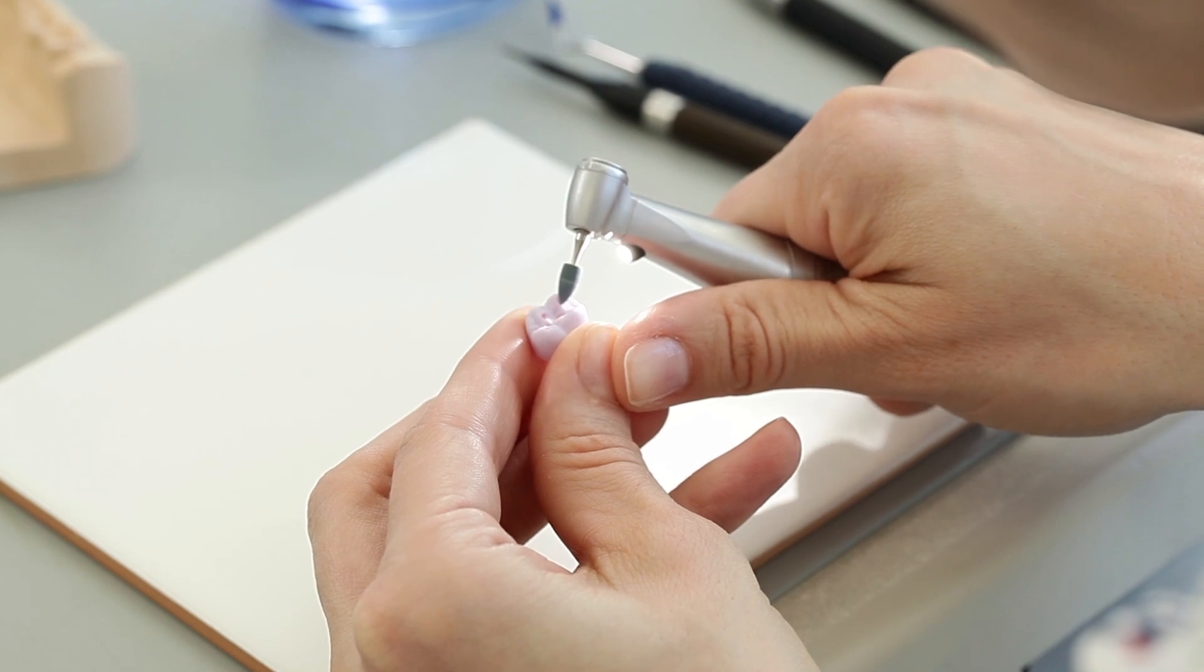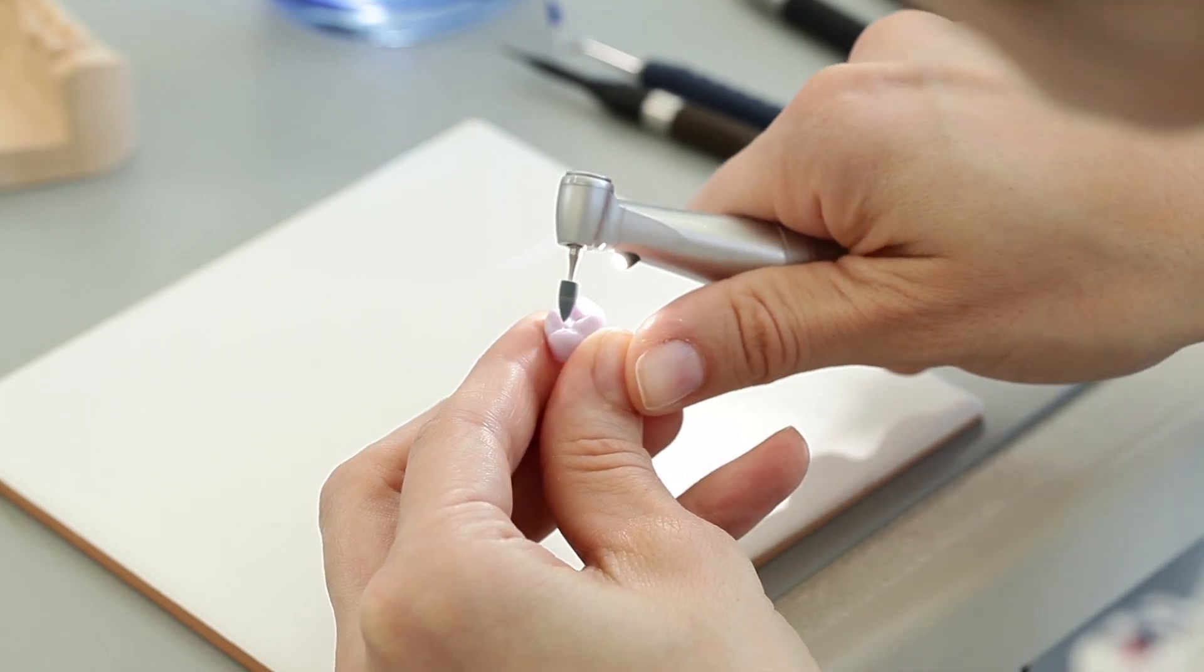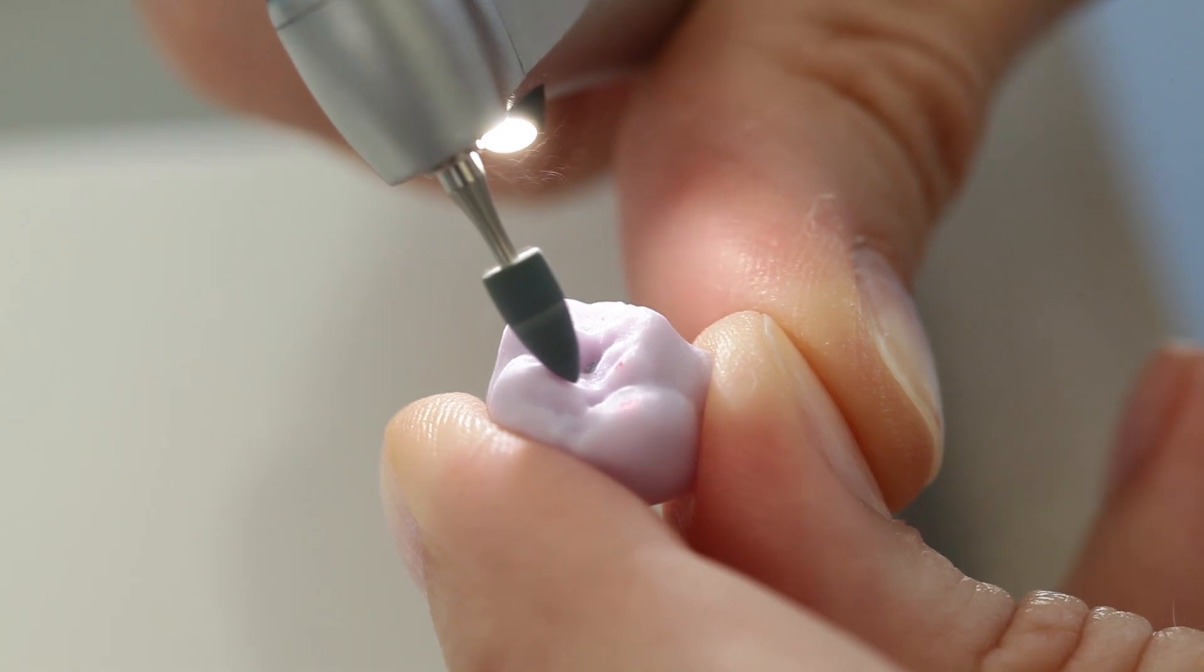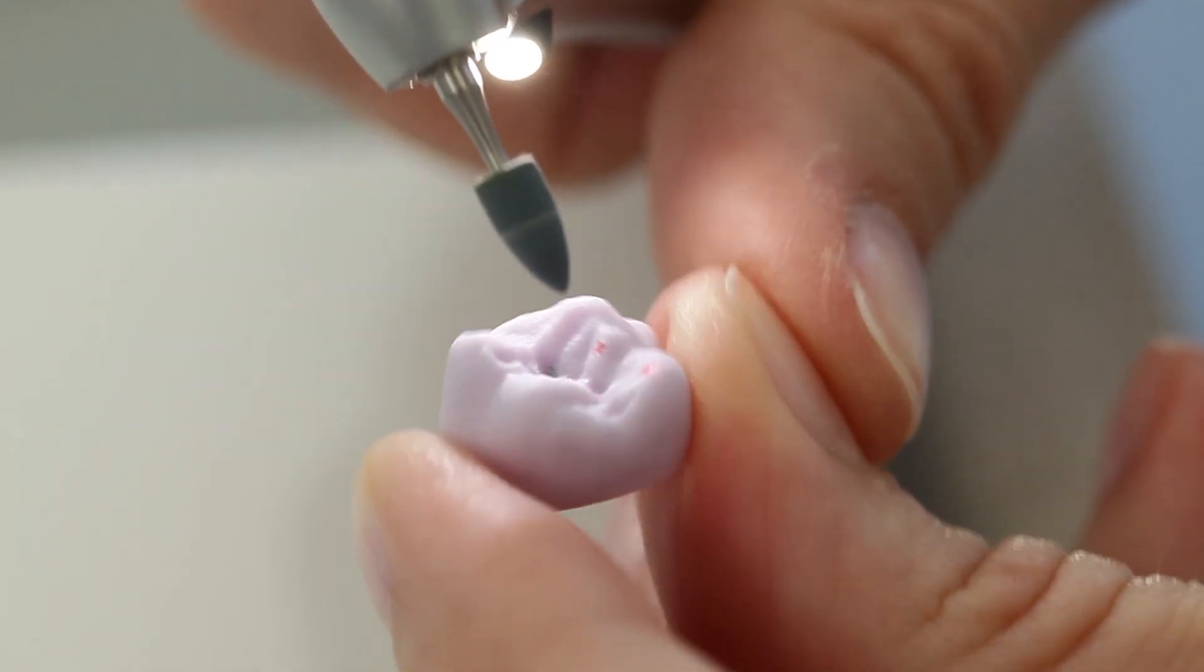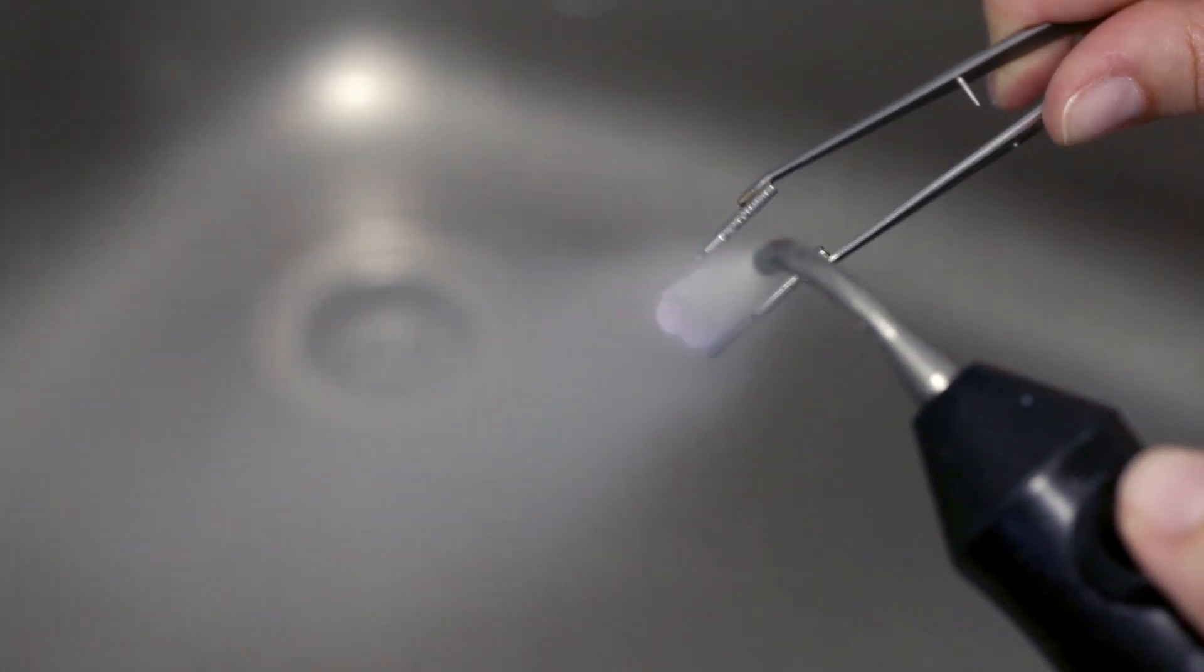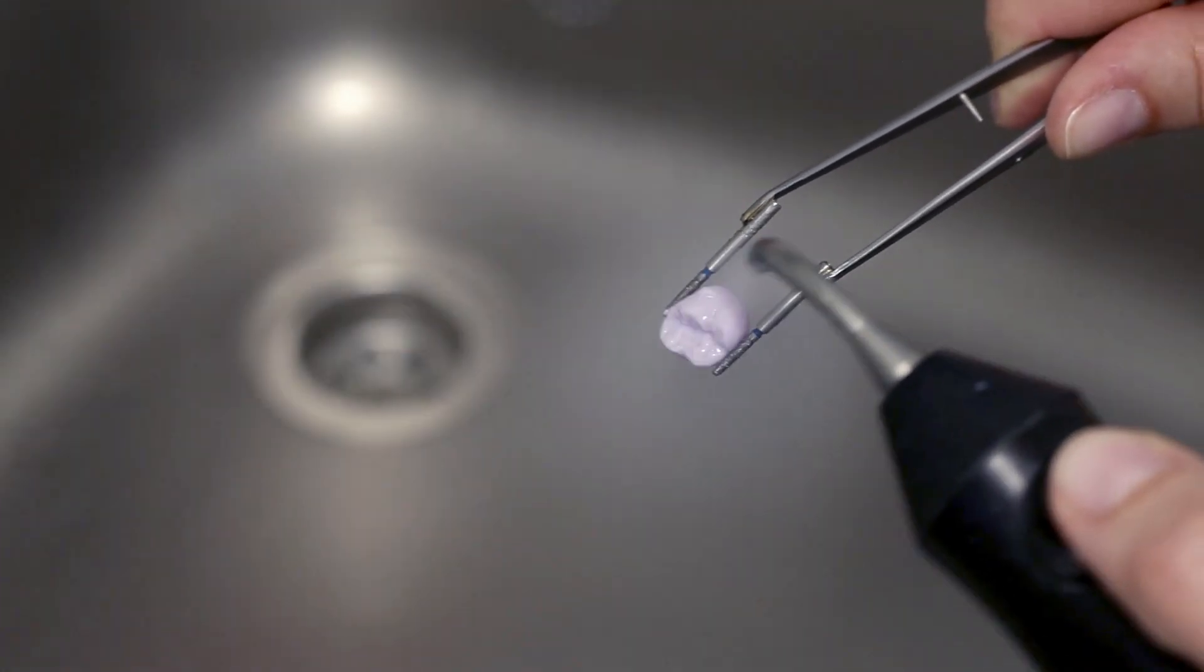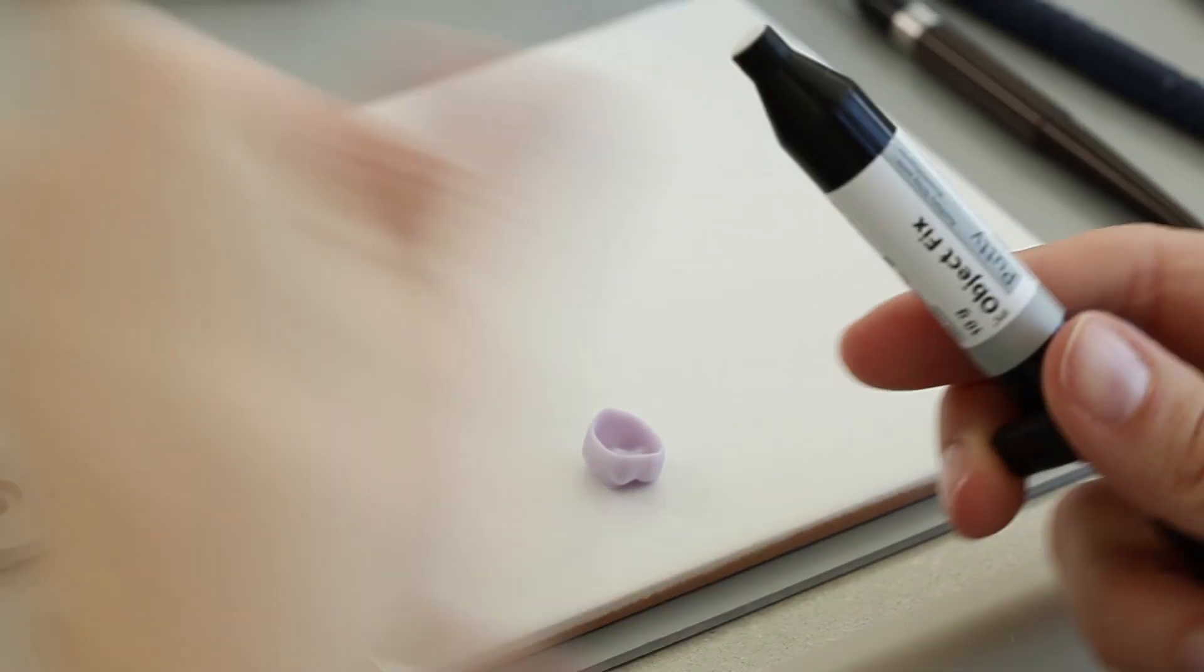Surface grind the entire occlusal surface and smooth out the structure created by the CAD CAM procedure. Make sure to maintain the minimal thickness. Clean the restoration before continuing with the next step. Either blast with a steam jet or use ultrasound in a water bath.